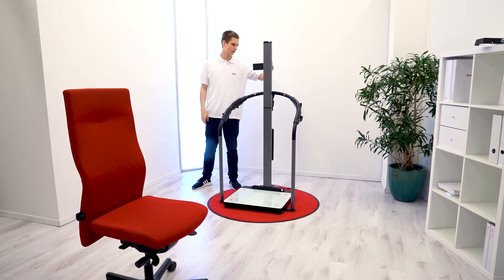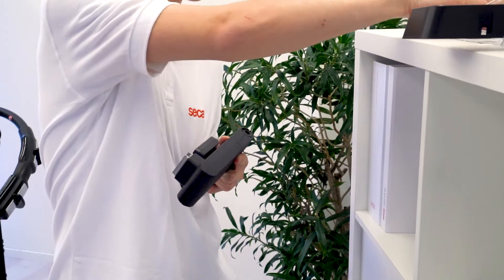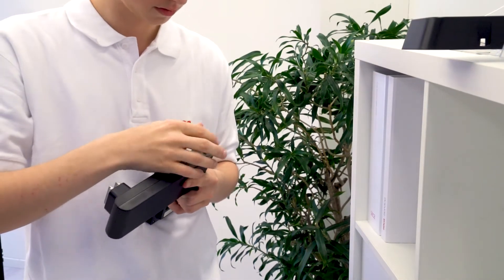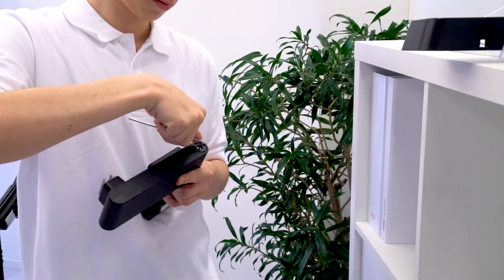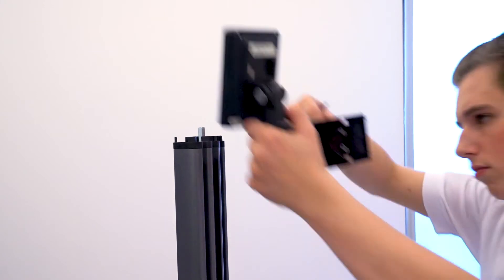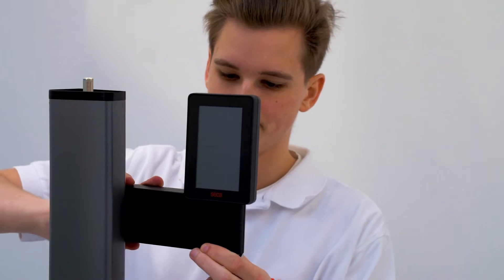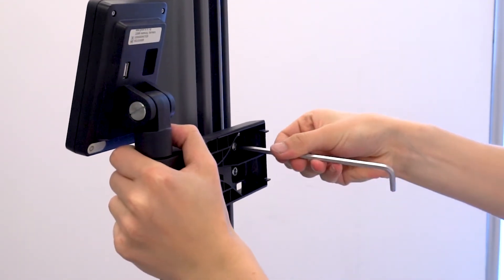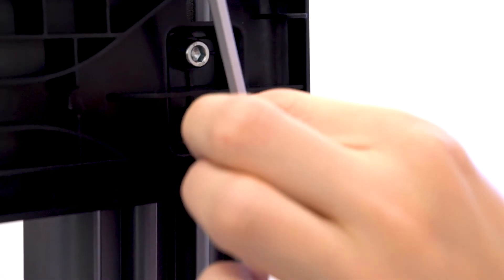Decide on which side of the column you would like to mount the display. Turn the arm accordingly and attach the display to the arm using the 3 mm Allen key and the M4x70 screw. Remove the rear cover of the display holder and put it aside. Slide the arm through the cable duct and secure the display such that the top of the display is level with the upper profile connector of the column. Secure the holder in position by tightening the two screws inside the arm with the 5 mm Allen key.